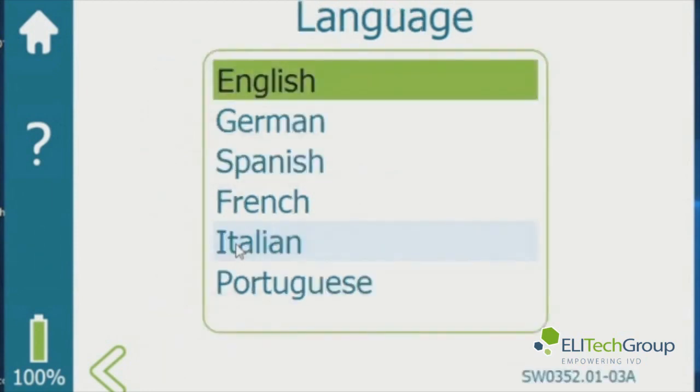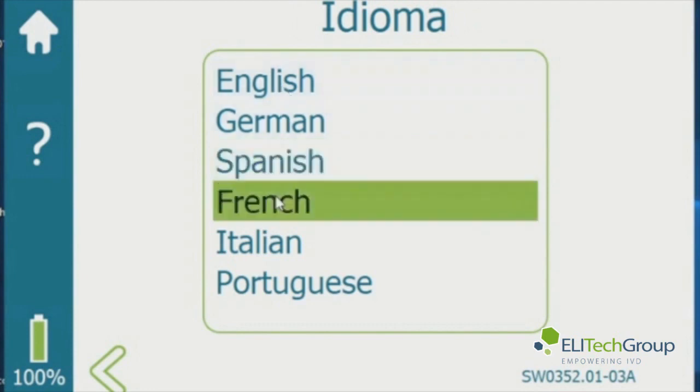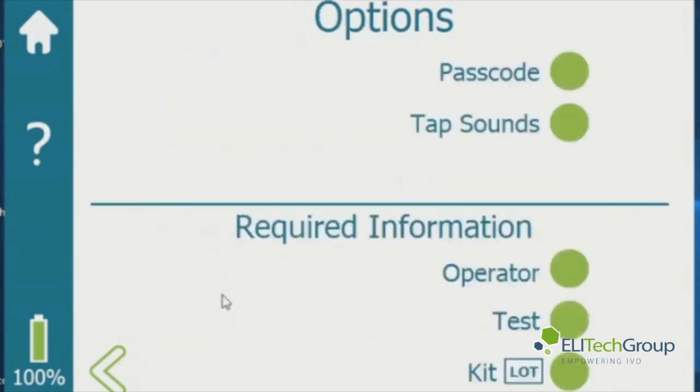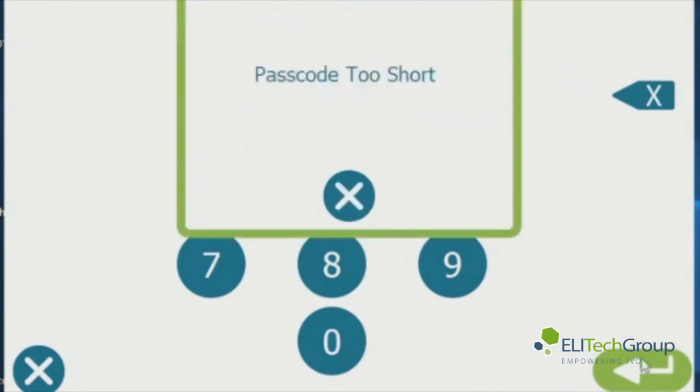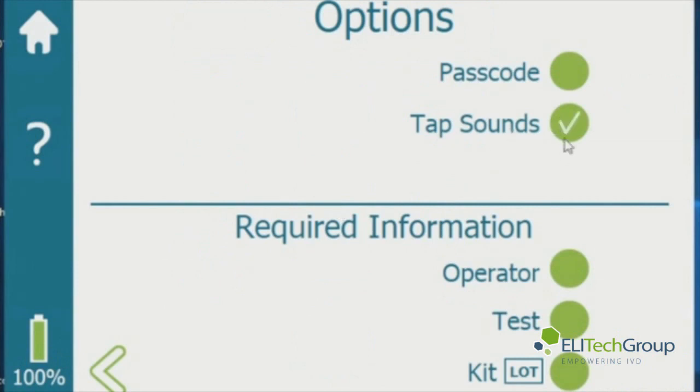Go to language — there are six languages you can choose from. Just highlight the language you would like and hit the back arrow and it has saved it. Now you can go to the options: you can set a password protect so you need a password to access some information, enable tap sound when you touch the screen, and require operator, test information, and kit lot number if desired.